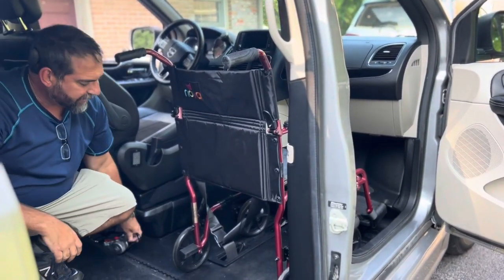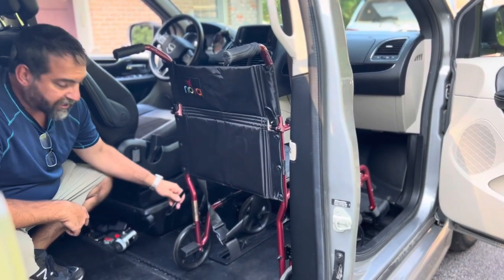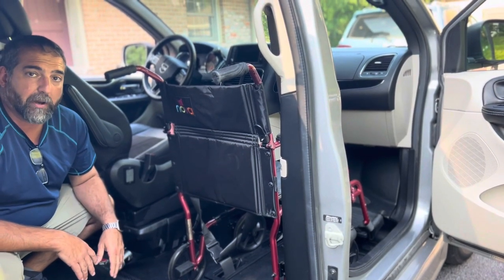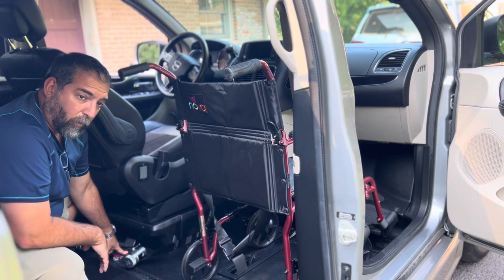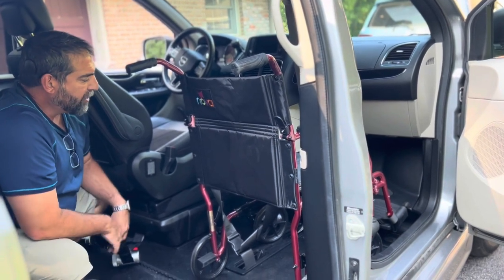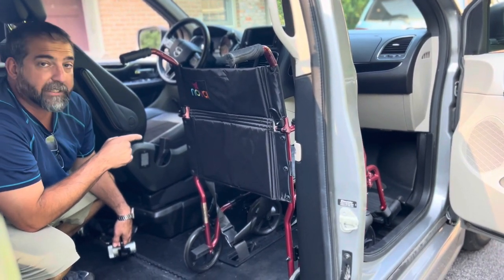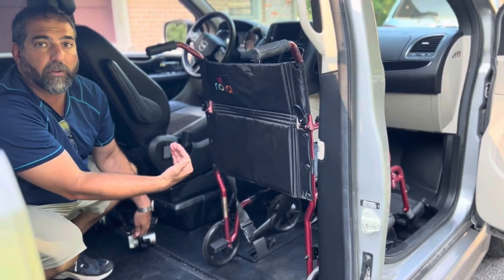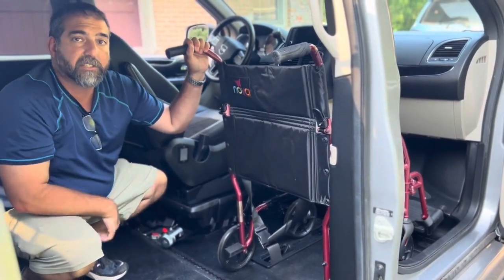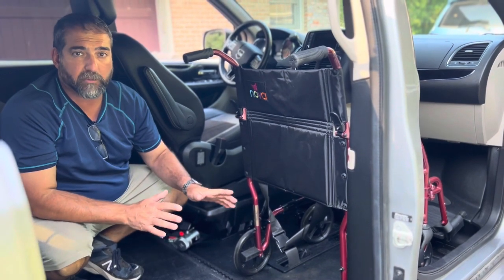Step two is to secure the wheelchair with one of these grappling hooks from the rear. This is a self-retracting hook — once you connect it, it's tight and you don't have to worry about it. To release it, press and hold the little red button and pull it to release some slack. Step three is to connect a hook from the front, so that the chair will not move forward and will not move backward. Make sure you connect it to the frame of the wheelchair, not to a wheel or something movable, as that won't be as secure.